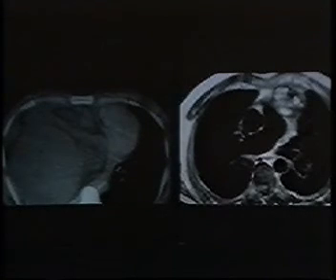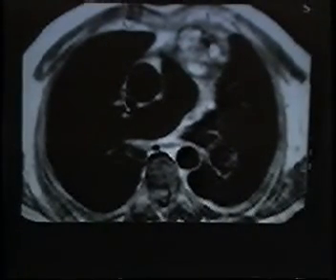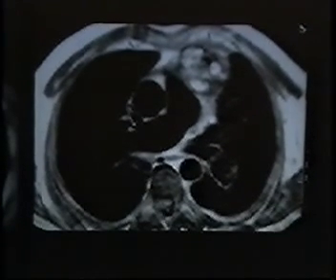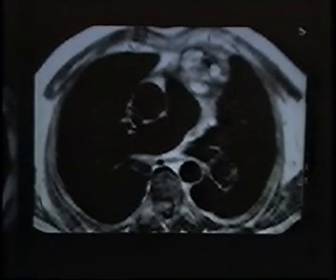The diagnosis when you have a mass in the paracardiac region, either CT, this is a malignant teratoma, or MR, this is a thymoma with hemorrhage within it. It doesn't pay to fool around with other techniques. You just go where you can get the most information. Either MR or CT will suffice to diagnose these lesions.